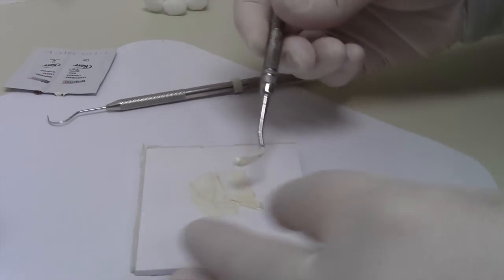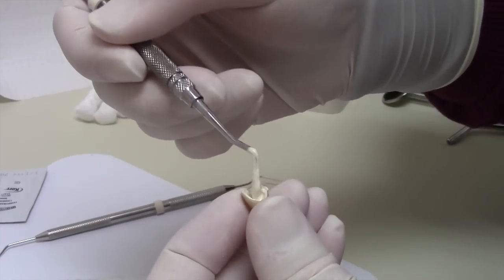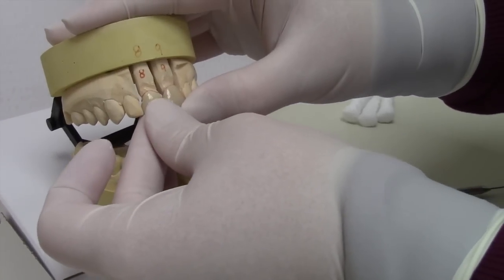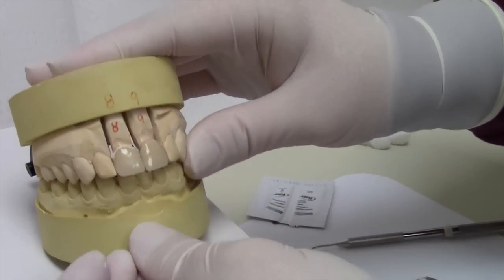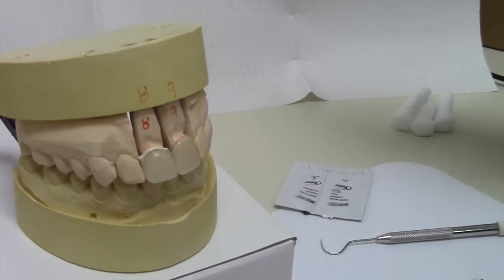Place cement into crown, not overflowing. Then place crown onto tooth. Firmly bring teeth together to assure an even bite. Wait one full minute for cement to fully harden.